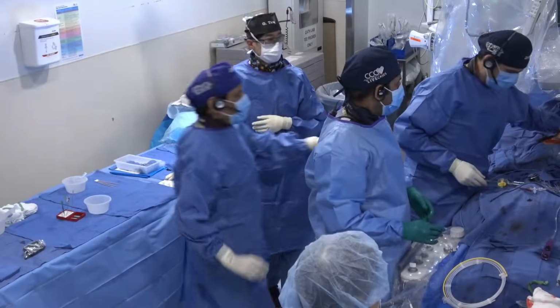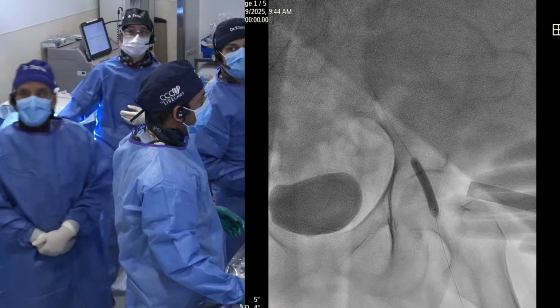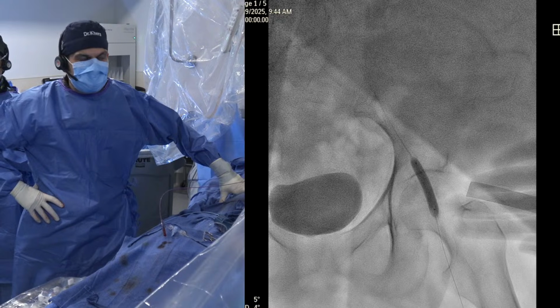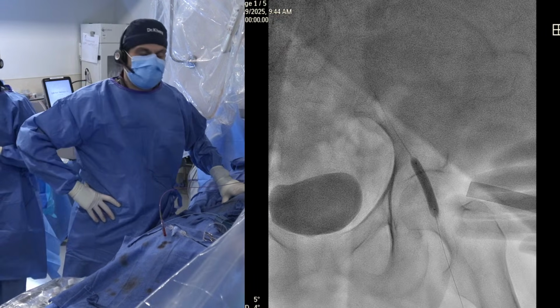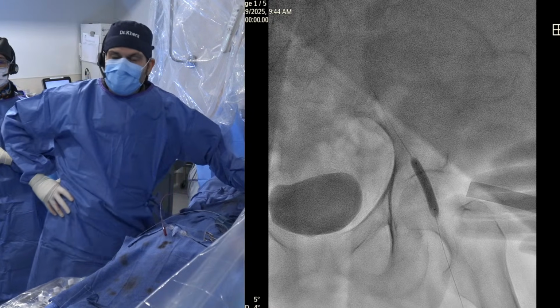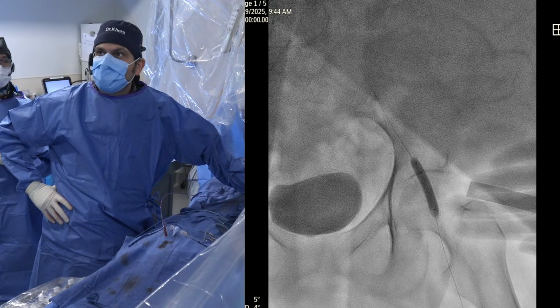Keep on saying, go onto the fluoro, show what you're doing, so that everyone sees how we are closing the arteries here. Yeah, so go live first. This patient has a very high BMI, and these are the kind of patients I do an up and over and do a dry closure, that is a balloon tamponade. The reason is when they start ambulating, if any of the suture pops, it becomes a big issue. So any patient who has a high BMI or you cannot reverse anticoagulation, we tend to use more up and over and balloon tamponade in the end.